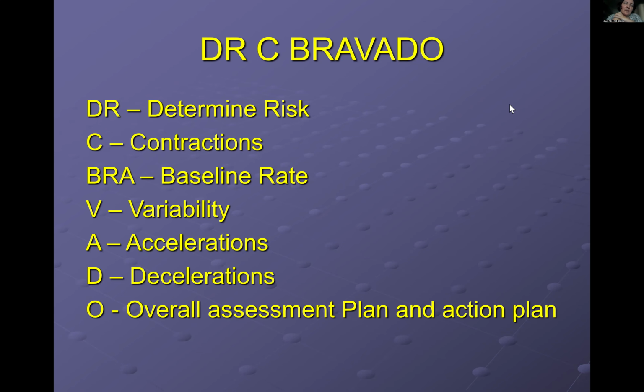They need to go hand in hand, especially during labor, because as you are seeing the changes happening in the heart rate, whether they are normal changes or abnormal changes, you are able to make the decision based on how they're changing with the contractions.